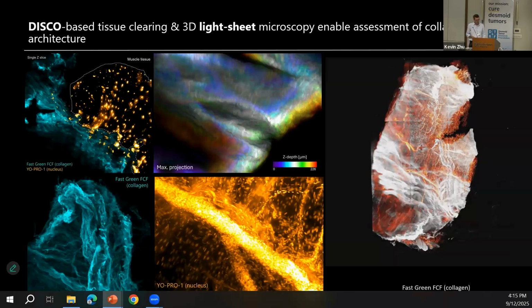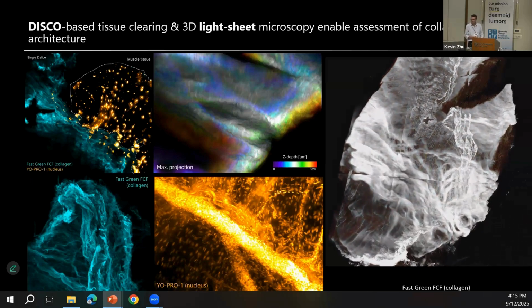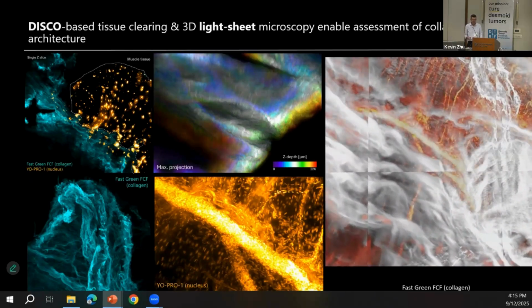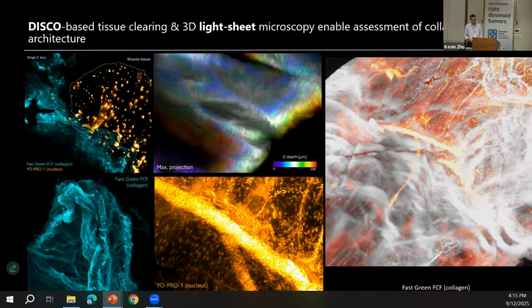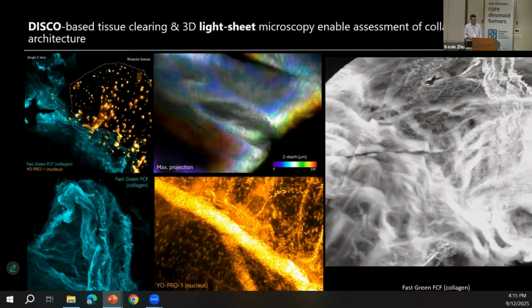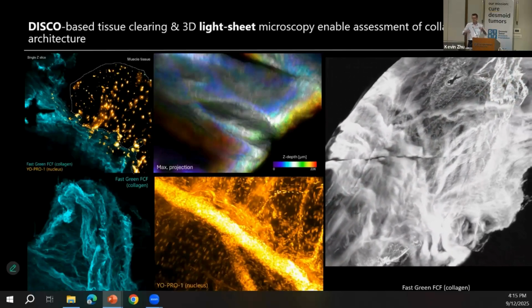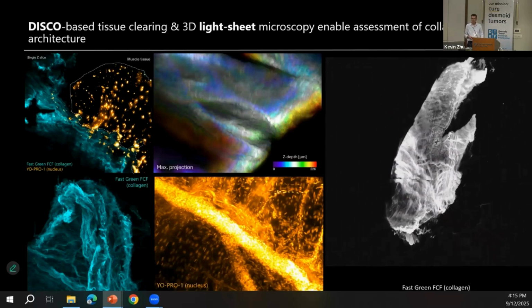So these are our own images here of a desmoid tumor, and I have to say that stitching needs some improvement, but we need to do the stitching on a stronger computer, in fact. What you see here in red are the blood vessels that are coming up. Because the erythrocytes in amphibia and in birds are nucleated, you can actually see the blood vessels. But this allows you to get now the complete architecture of the complete tumor, also where it's infiltrating and so on and so forth.